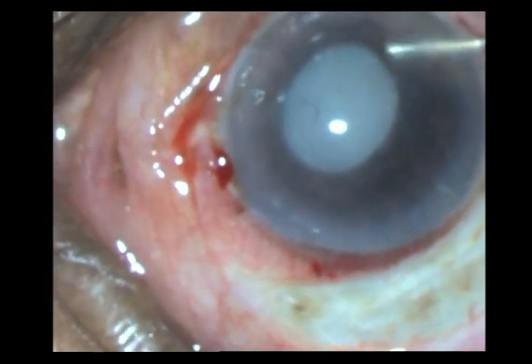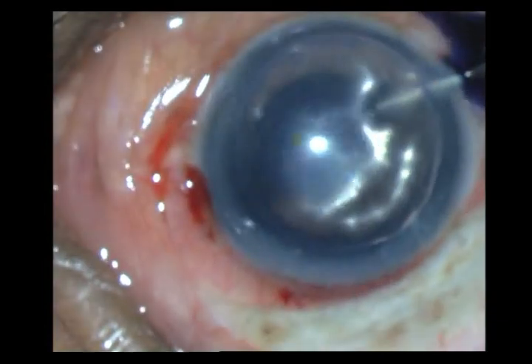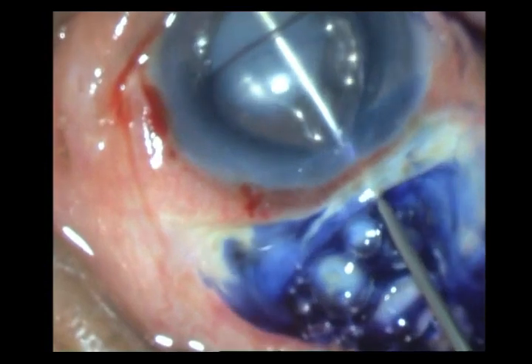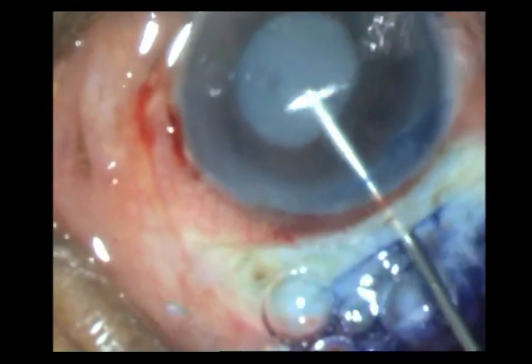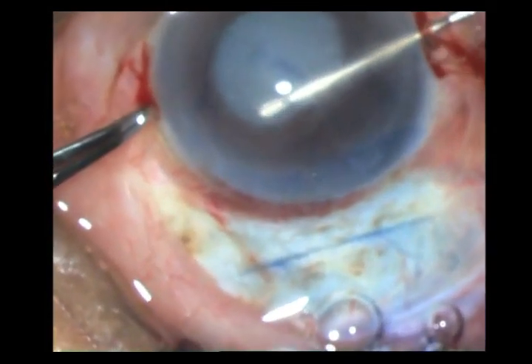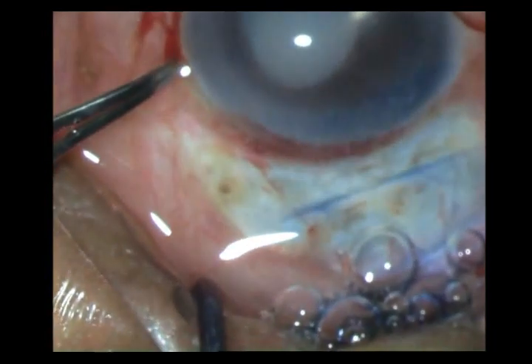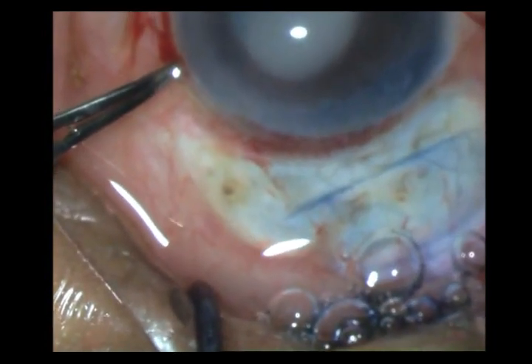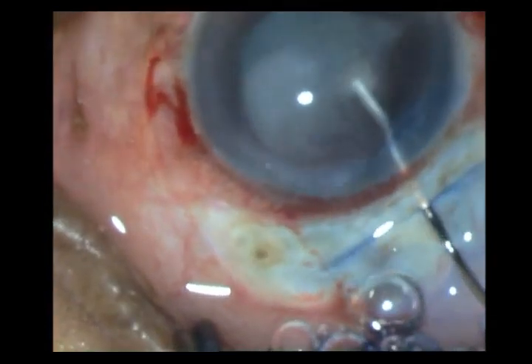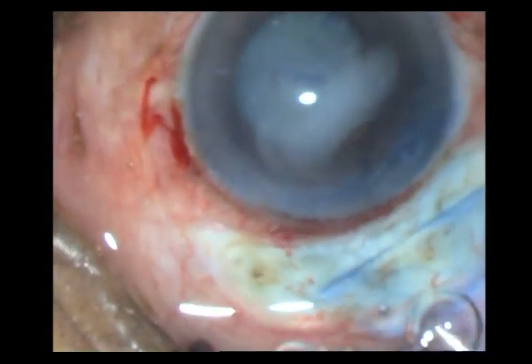I place an air bubble, after which I stain the anterior capsule with trypan blue and expel both with 2% HPMC. I then take my 26-gauge needle and make a superior flap — I am not going from the inferior side. Watch very carefully, and just wash out the fluid that has egressed into the anterior chamber and place some more HPMC.